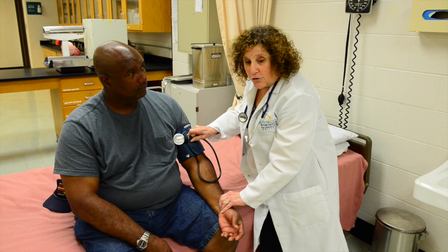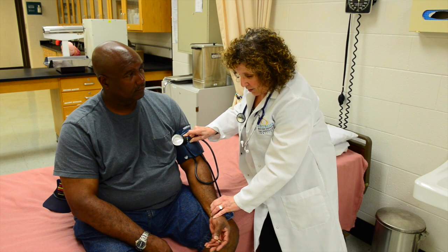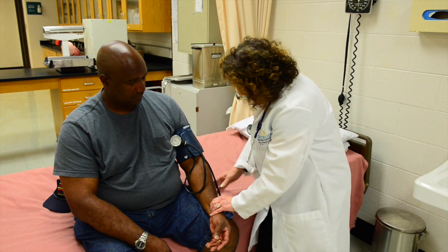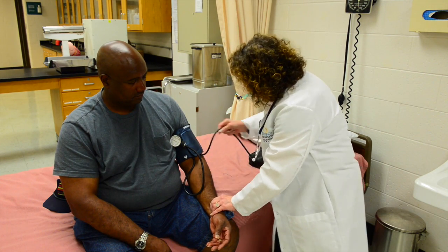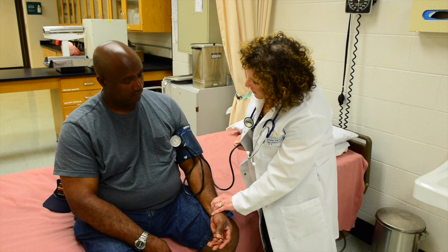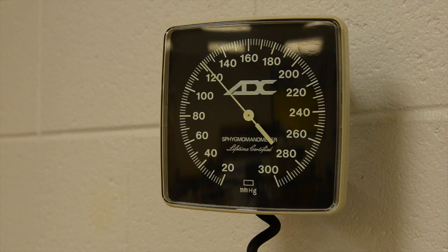Now you determine his pulse. I'm feeling his pulse, and at this point I'm going to take the bulb and inflate it until I no longer feel his pulse.